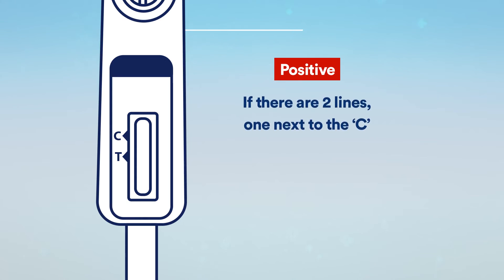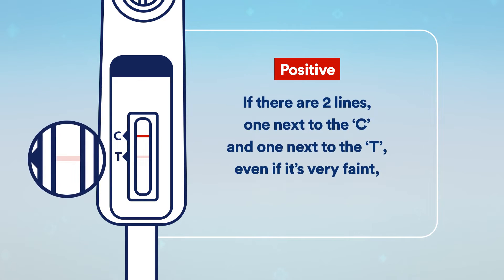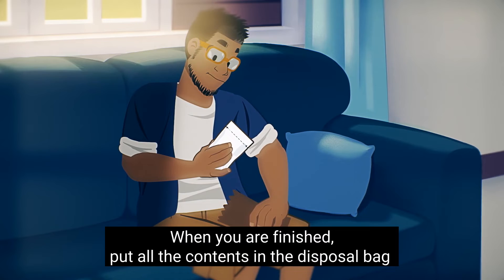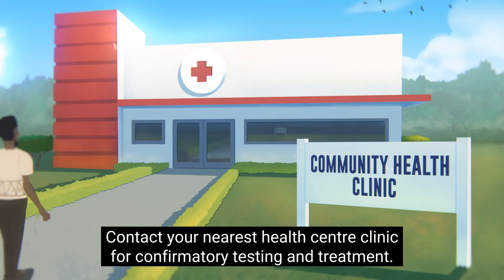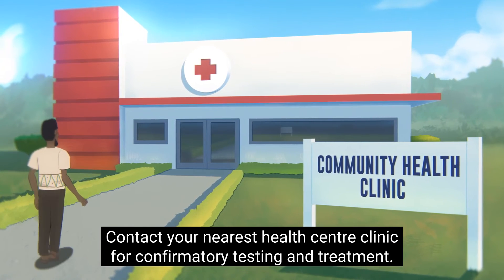If there are two lines — one next to the C and one next to the T — even if it's very faint, the result is positive. When you are finished, put all the contents in the disposal bag. You may discard all test components in the garbage.